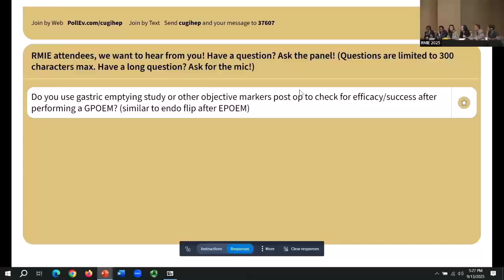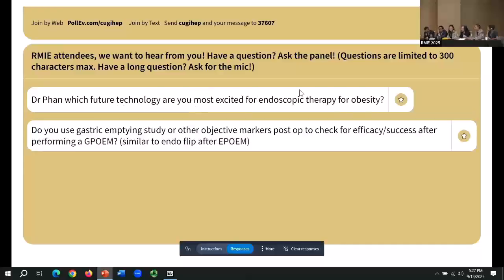Agreed. And just one thing, like the MOD reports, so a 12% rate of perforation with the duodenal stents when the stent is misdeployed. But when the stent misdeploys with the EUS-GJ, it's 100% perforation. So that's something to understand. You've already made a hole and you have a stent dysfunction.